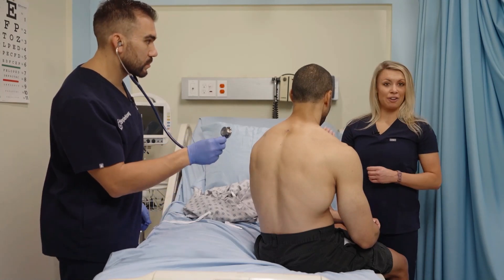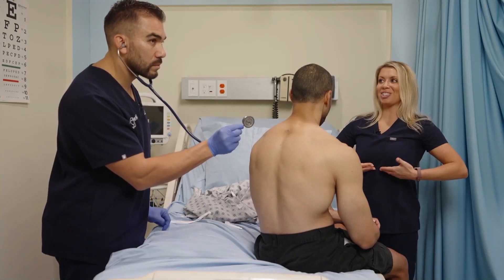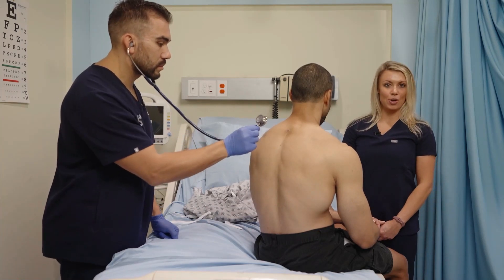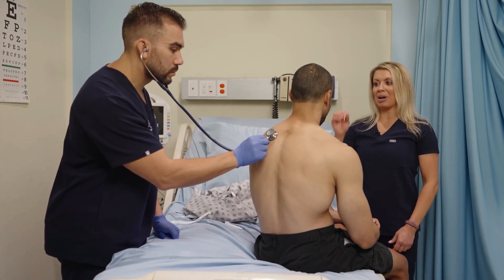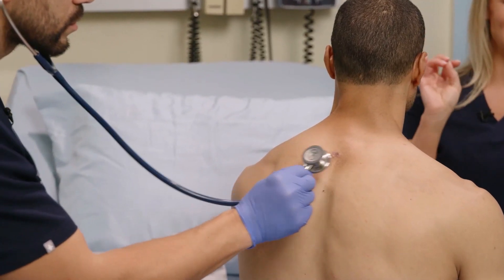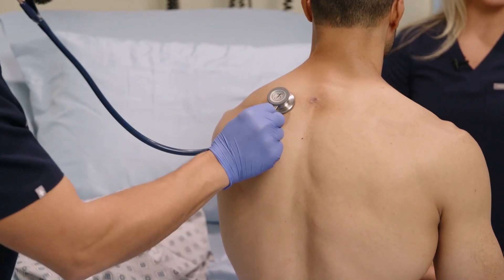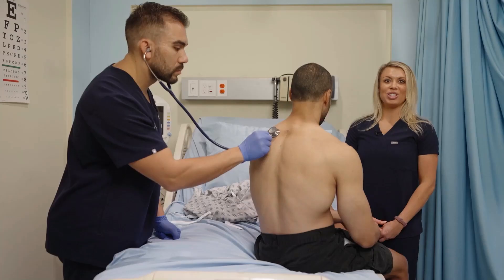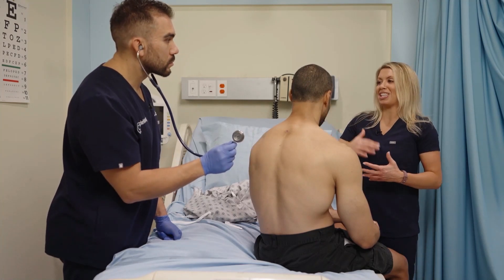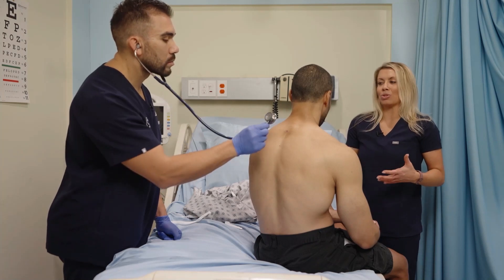You're going to use the diaphragm of your stethoscope. An easy way to remember that is it's lung auscultation — with your lungs, use your diaphragm to breathe — so you're using the large side, the diaphragm of the stethoscope. You're going to start up at the apices, up high on the back, and do that side-to-side zigzag pattern, having the patient breathe in and out every time you move your stethoscope. You want to hear both the inspiration and expiration, because some sounds only happen on inhale and some only happen on exhale.